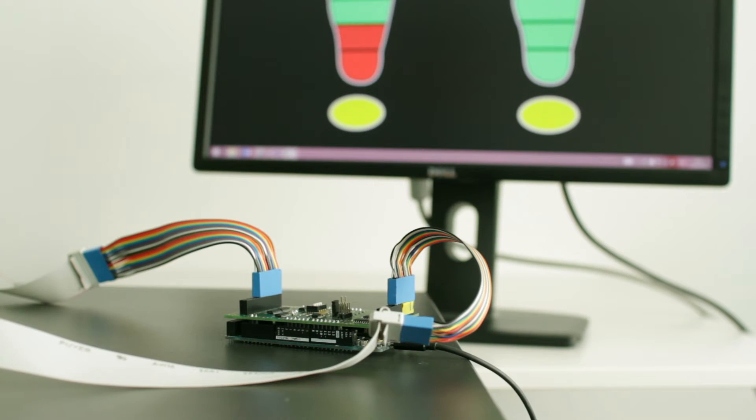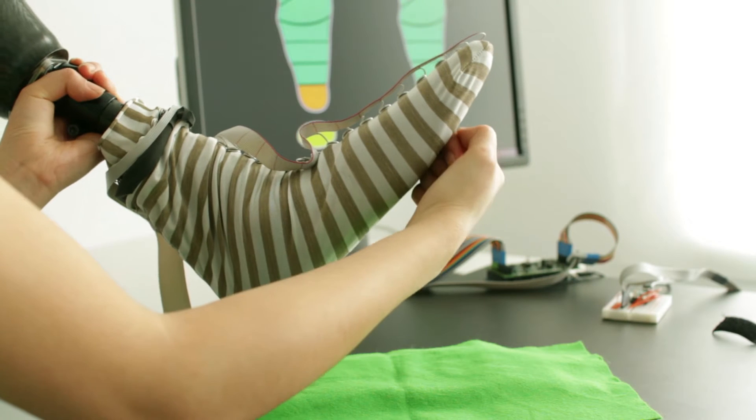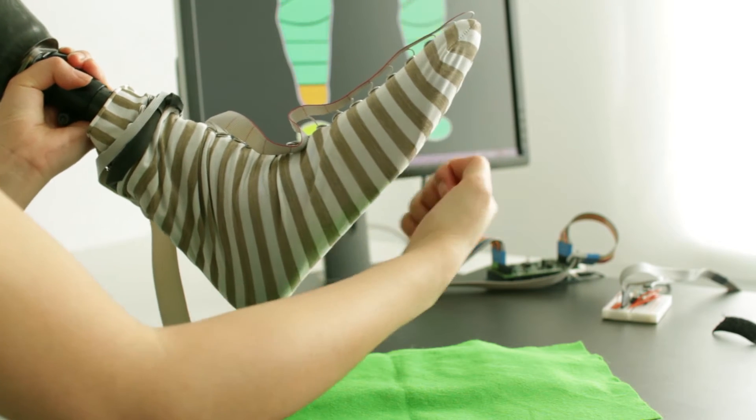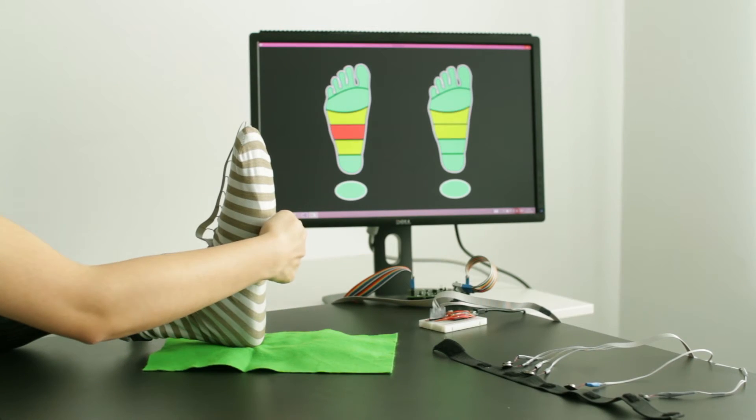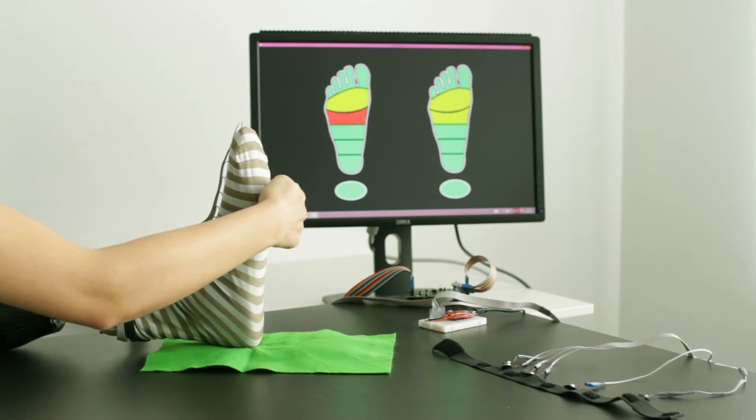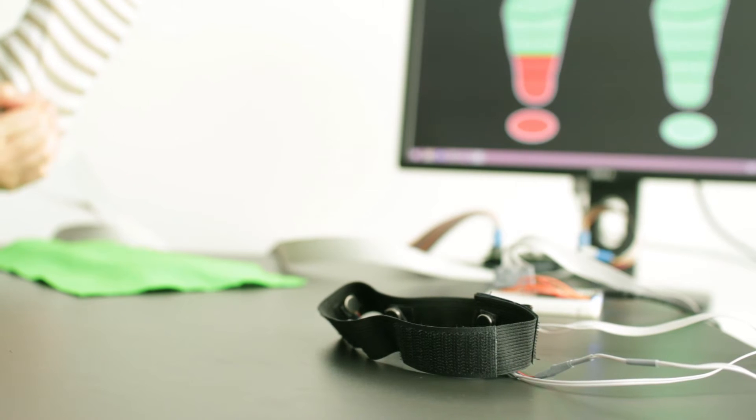It captures and transforms pressure information from the sensing sock into user-interpretable feedback, delivered to the user in the form of a haptic vibration band.